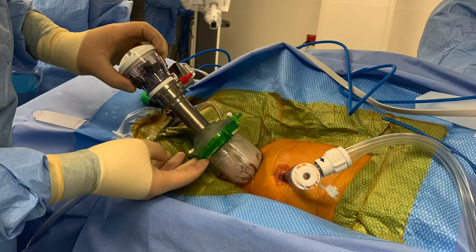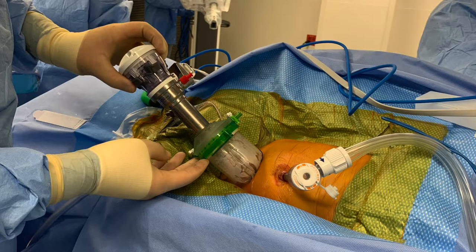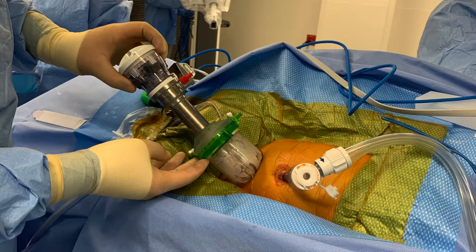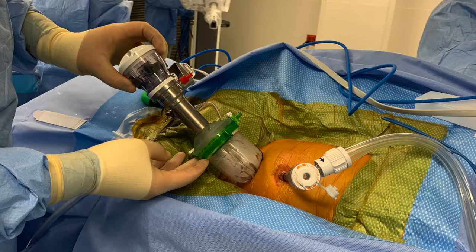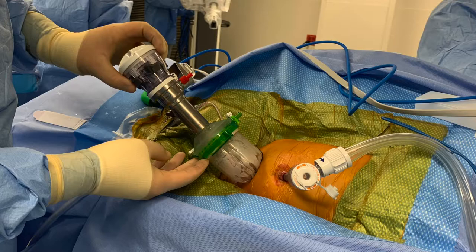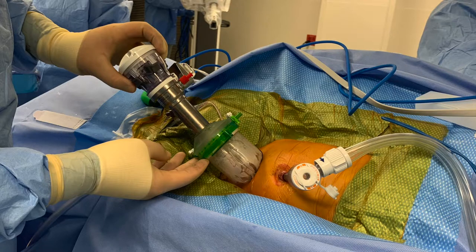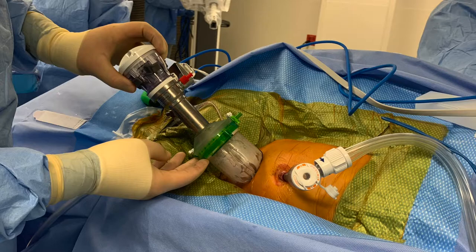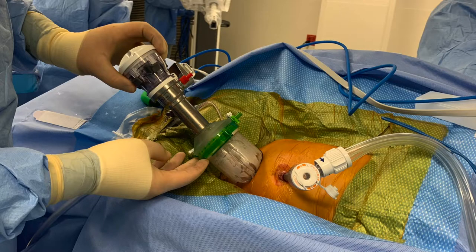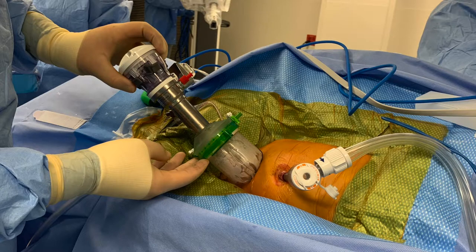This is a photograph of our trocar placement. I used a 5mm air seal port directly through the umbilicus to hide the incision, and then we used the DaVinci SP trocar through a mini gel port to help air dock, so to speak, and gain distance between the trocar and the target anatomy. This is necessary with the DaVinci SP system sometimes when operating on young kids.